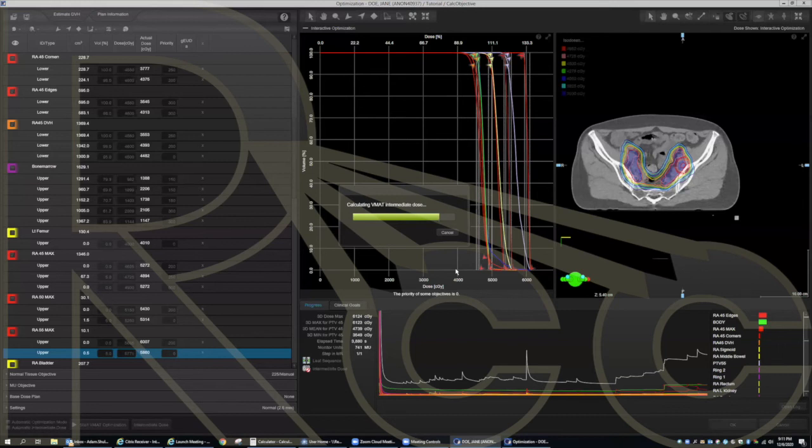But there's no perfect way of planning, right? We all have our different methods. We'll see a few different methods throughout this RCC course, which is great, so you can get ideas from different people. I was one of the people commentating on a couple other plans, and I actually learned a couple really nice things that I'm implementing into my own planning.